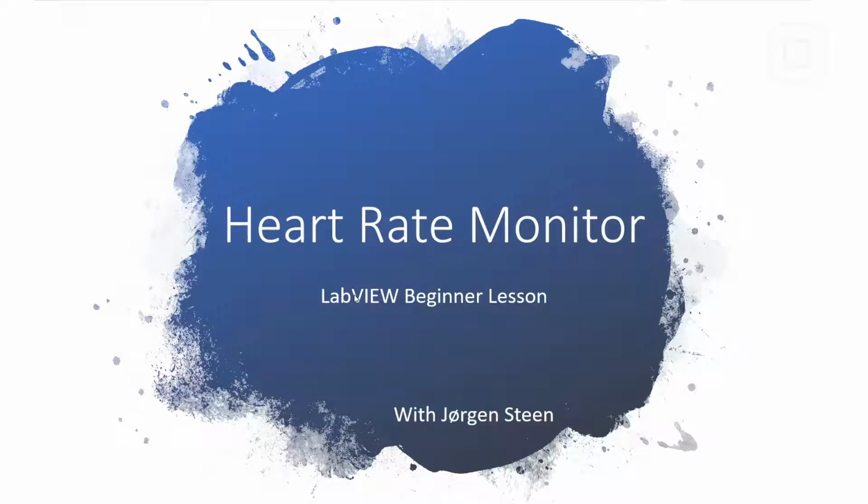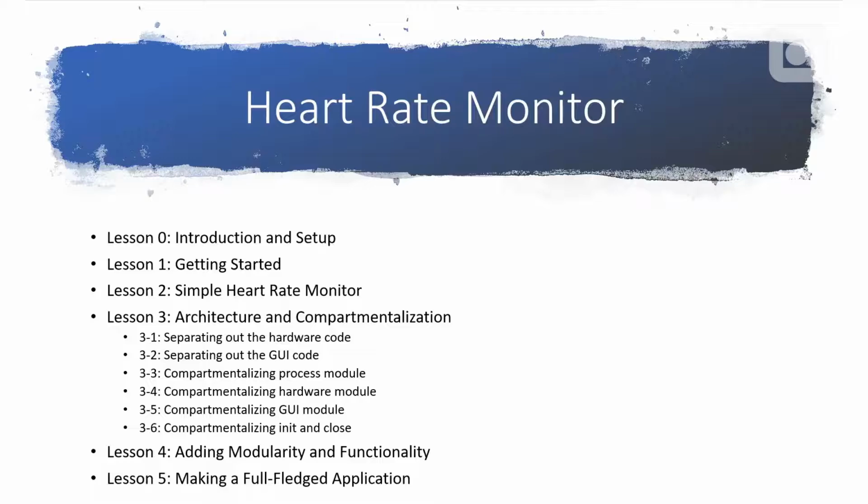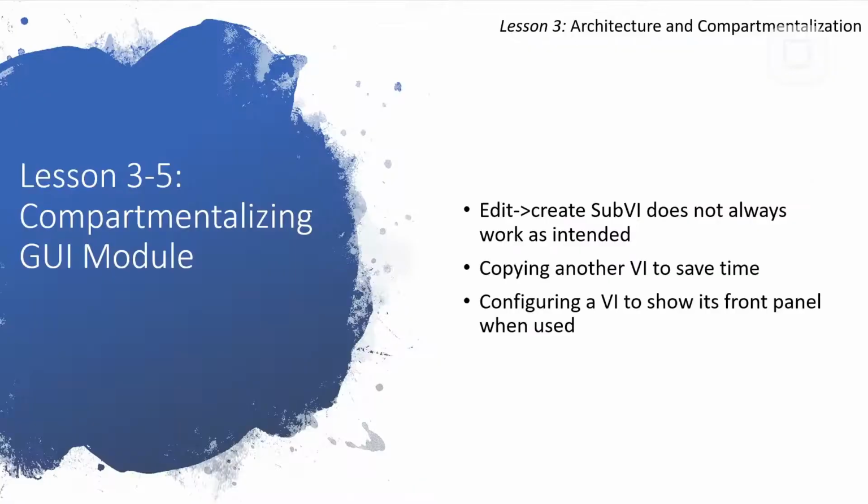This is a LabVIEW Beginner lesson, where we make a heart rate monitor. This video's lesson is lesson 3-5, Compartmentalizing the GUI module. In the last video, we compartmentalized the acquisition.